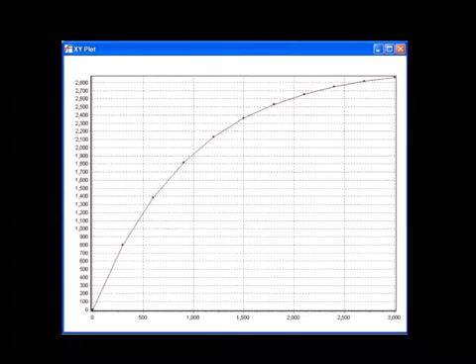It's important to keep track of this, because if you've got a really short buildup constant, you're probably giving up something in terms of polarization, or if you've got a really long buildup constant, then that may not be practical either. So do you want to be at 100%?